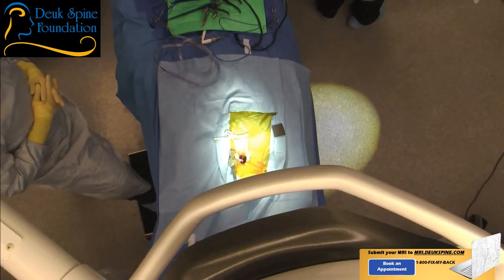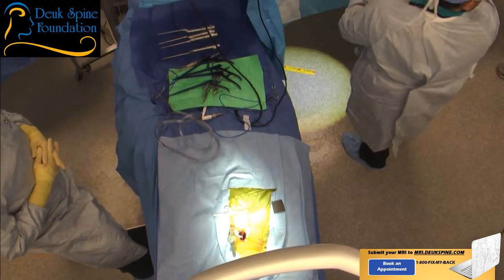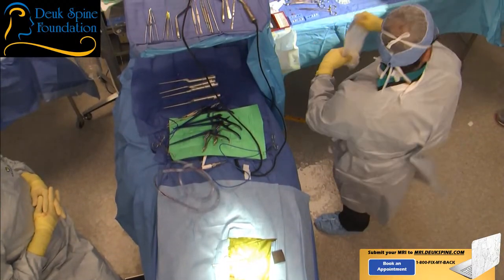So kind of to summarize where we are so far, we've done the exposure, which means exposing the spine, getting the retractors in. Whoa, whoa, loosen it first. Come on, guys.